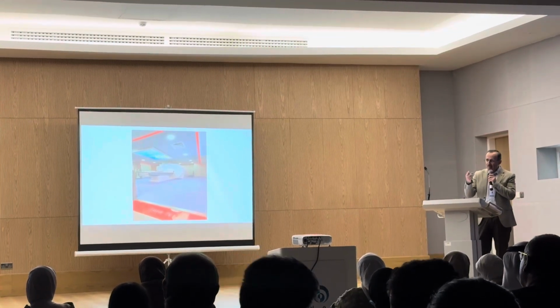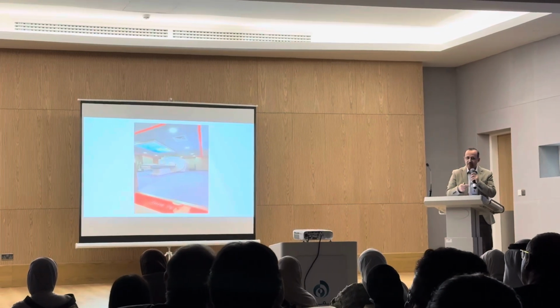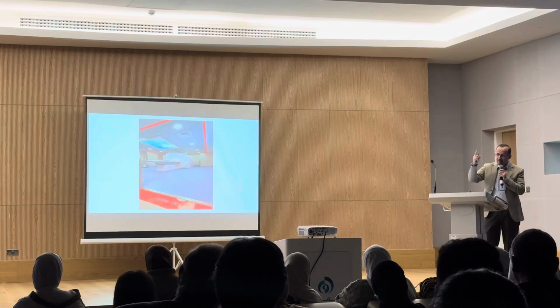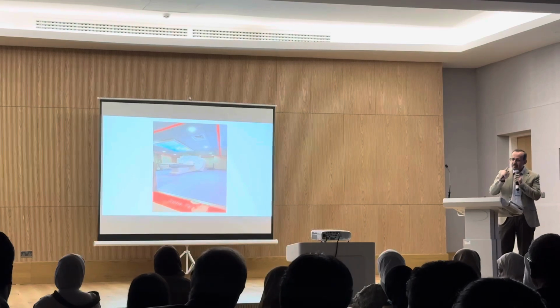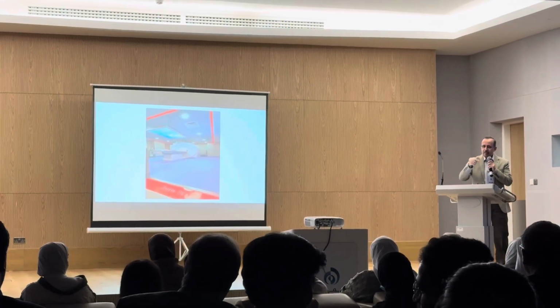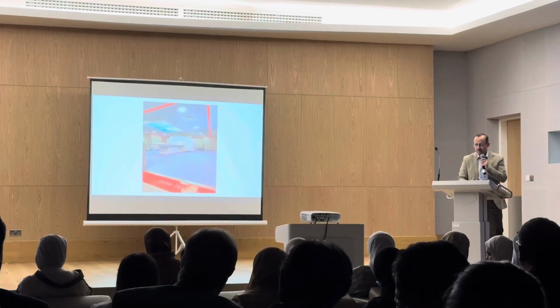RF frequency. By the way, the FDA report on the types of hazard in MRI patients classified heat and burn as number 1, due to the RF, the radio frequency energy; second is projectile damage; and third is alteration, damage, or malfunction of implanted medical devices.